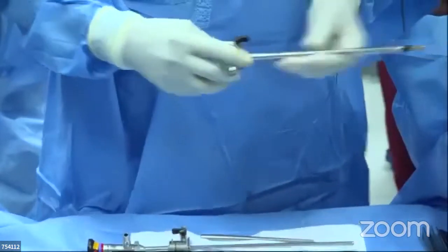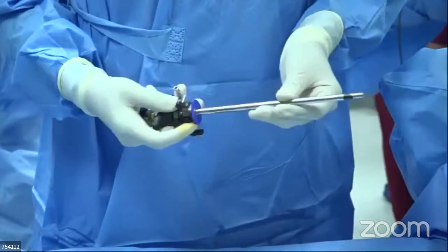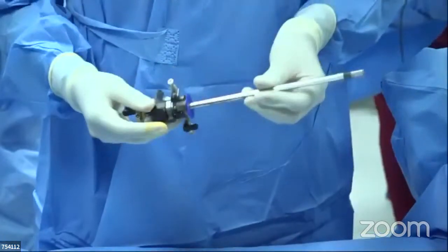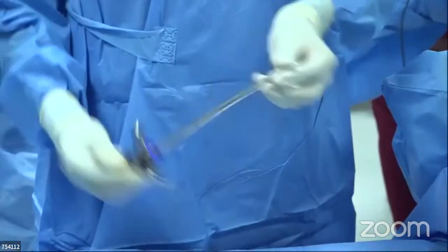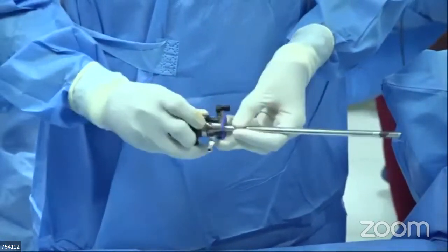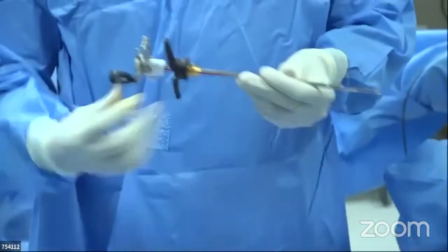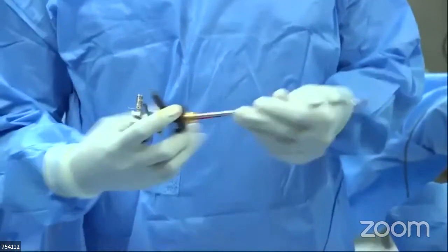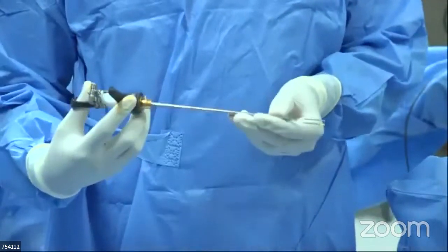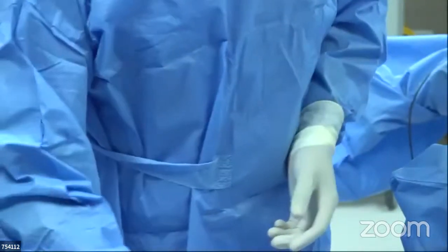Because this gland is only a 45 cc gland on ultrasound, we are using only a 24 sheath, which is not a continuous irrigation sheath. An Olympus 24 sheath is being used, and a visual obturator, which is already set in place. That's number one. And a passive working element, where passive means the thumb moves, and active means the finger moves. Finger movement is one of the favorites for many surgeons, but I think most people have shifted to thumb movement, which is very essential and commonly used.